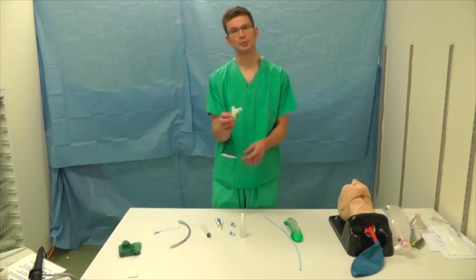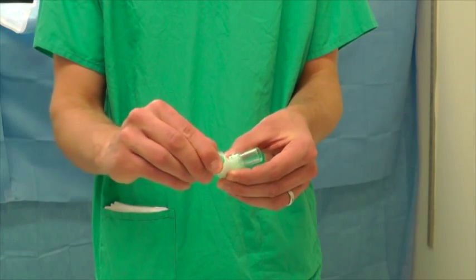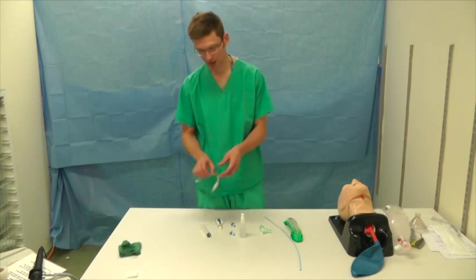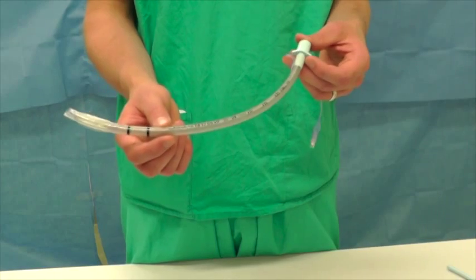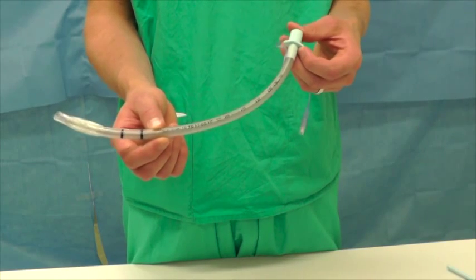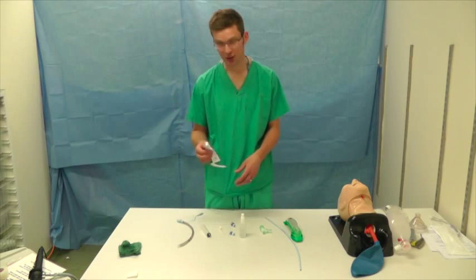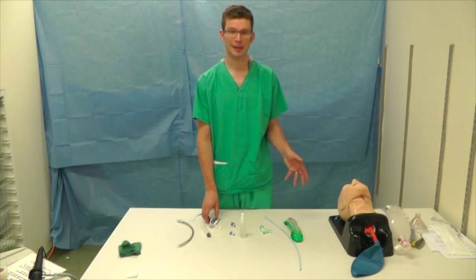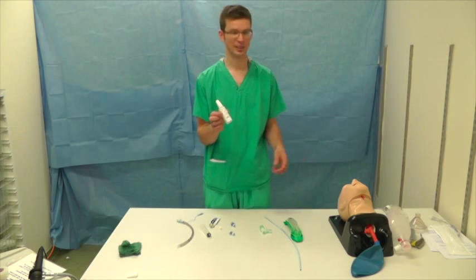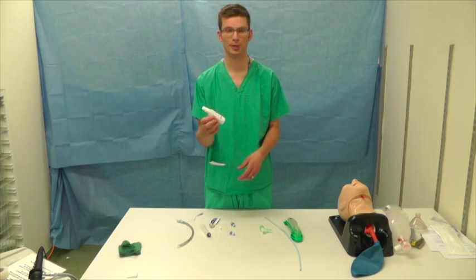You're going to need an angle piece with a self-sealing diaphragm — this means you can use the scope through it whilst maintaining anaesthetic and oxygenation. You're going to need a reinforced tube; we advise using at least a size 7. A size 6.5 is very difficult to railroad over an Aintree and a size 6 just won't go. In addition to water-based lubricant, when practising on a mannequin you also need some mannequin lubricant to help with insertion of the LMA and passage of the catheter — you wouldn't need this on a real patient.